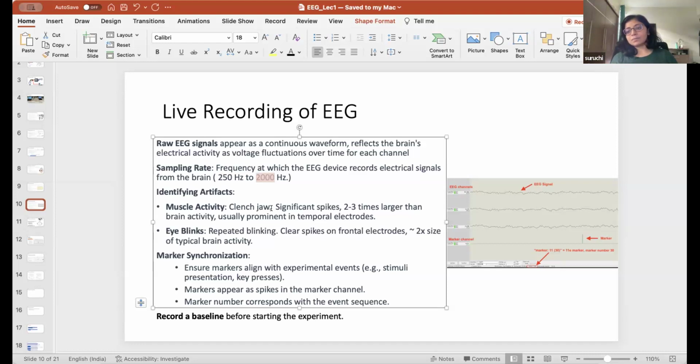So this gives us a lot of data for pre-processing. We pre-process and then reduce it, so that the file sizes get reduced. But yeah, initially we can set it at high actually, which is 2000. Yeah. So it is generally set at high, because pre-processing can make use of more data, and then we downsample it and keep the downsampled data. But your raw files would be a little larger because of the higher sampling rate, and then your post-processed files would be at a lower frequency.